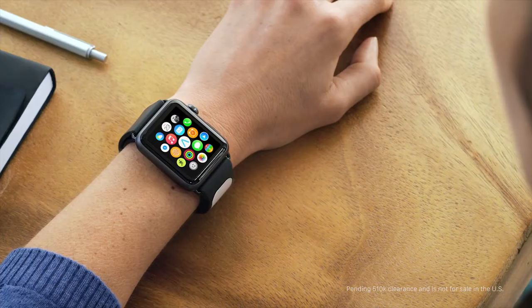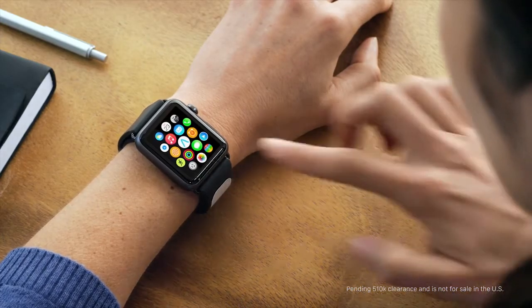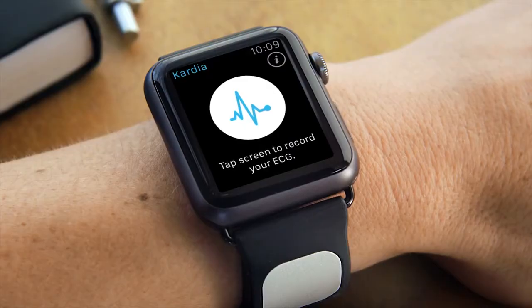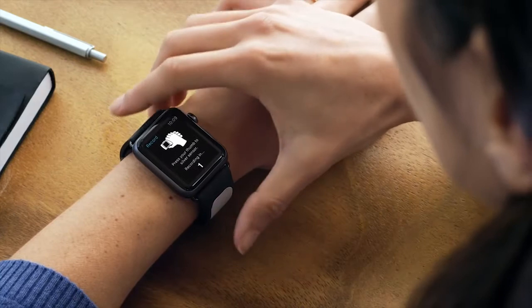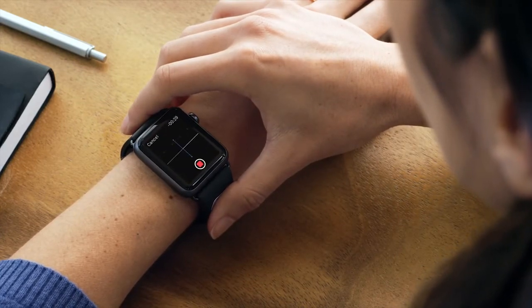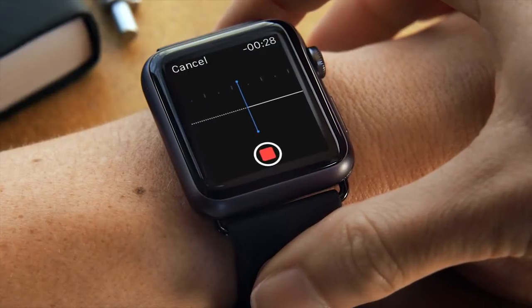To use Cardia Band with your Apple Watch, select the Cardia app on the home screen. Open the app and tap here to record an EKG. Place your thumb on the electrode, and if you're experiencing any symptoms, say them aloud as the clock counts down from 30.